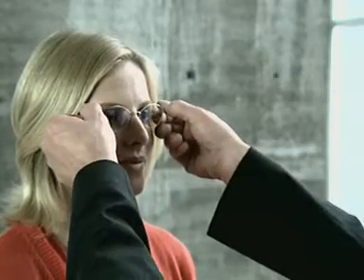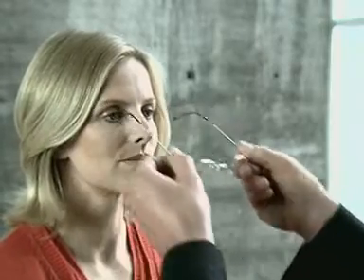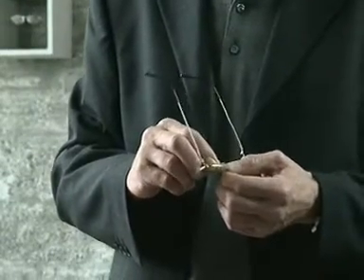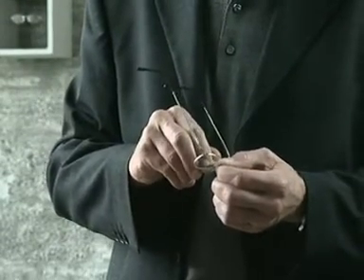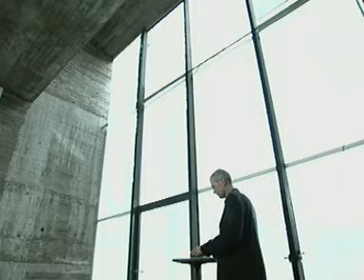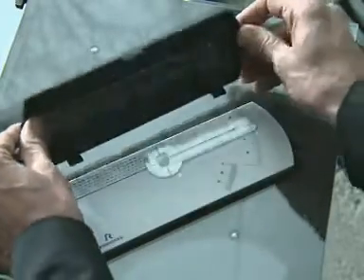All parameters depend on the selected prescription frame. Exact fitting before the measurements are taken is therefore of great importance. With Rodenstock's new measuring tools, you can determine the individual data in minutes.